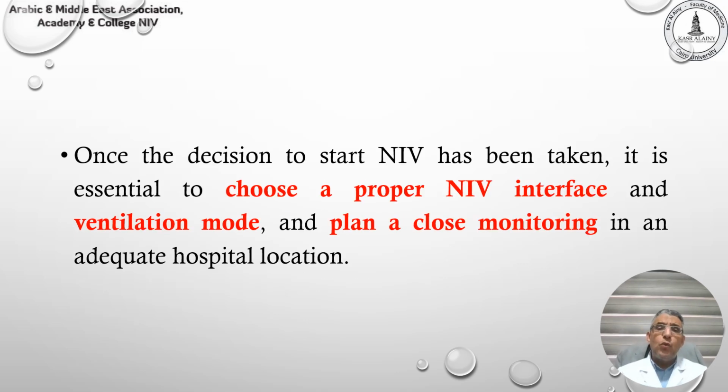However, once the decision to start non-invasive mechanical ventilation has been made, it is essential to do three things: to choose a proper interface. The interface is the key to success or failure of non-invasive mechanical ventilation. So proper attention should be paid to the interface and its complications, also the ventilation mode, and lastly, to plan very close monitoring in an adequate hospital location.